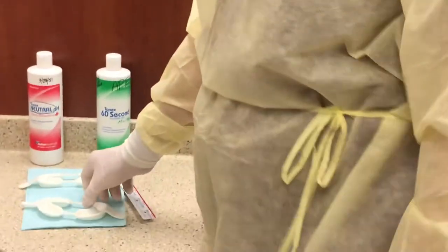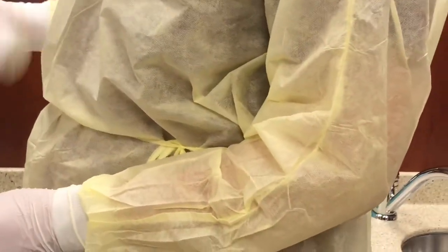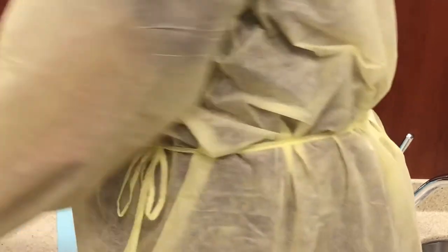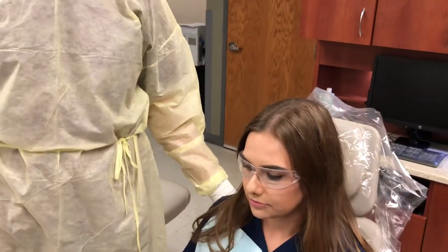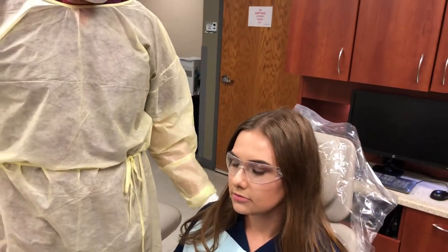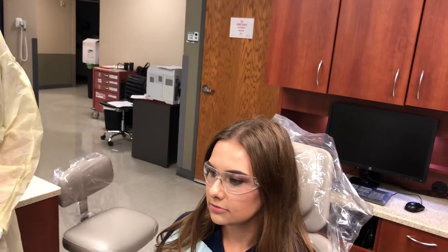You will instruct the patient not to swallow the fluoride. Raise the patient chair so that the patient's mouth is level with the clinician's elbow. Seat the patient in an upright position with head tilted forward slightly throughout the procedure.